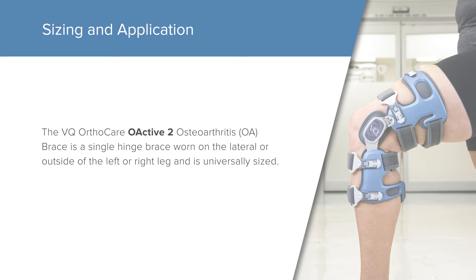The VQ OrthoCare O-Active II Osteoarthritis or OA brace is a single hinge brace worn on the lateral or outside of the left or right leg and is universally sized.